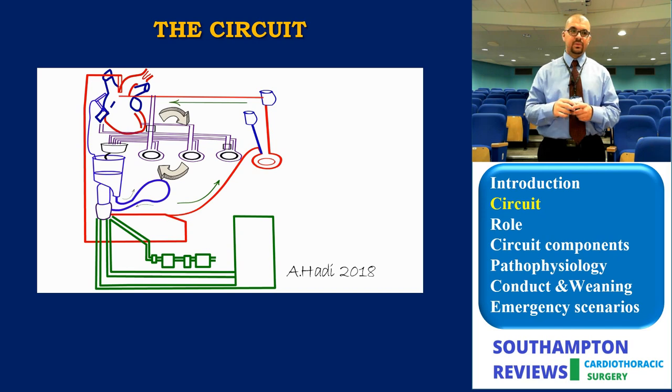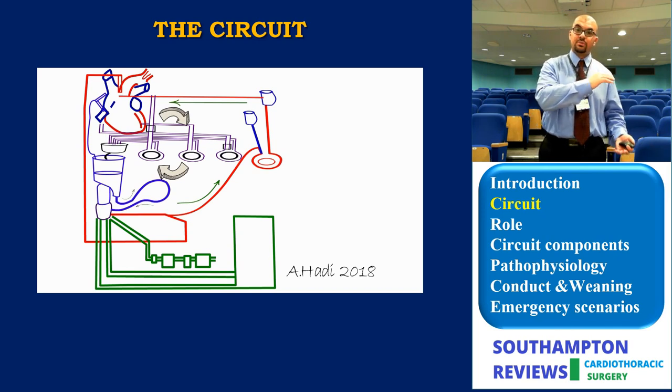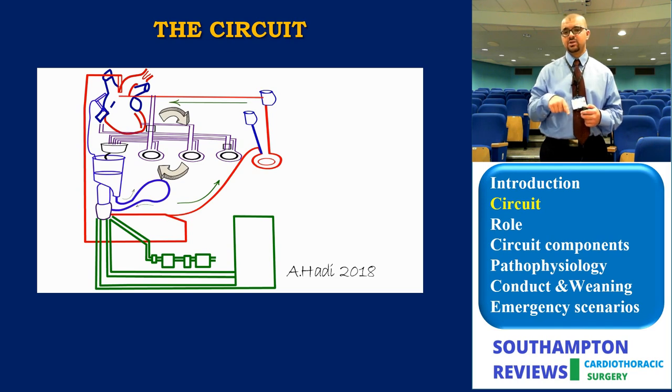For instance, the reservoir needs to be at a lower level than the heart. We already mentioned that. Otherwise, you will not receive venous return. Also, the heat exchanger must always be upstream to the oxygenator. You warm or you heat the blood before it gets fully saturated with oxygen.